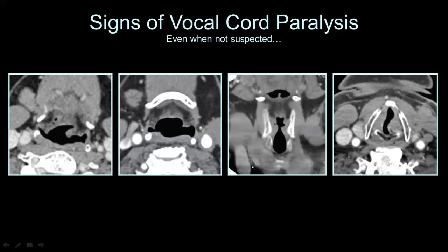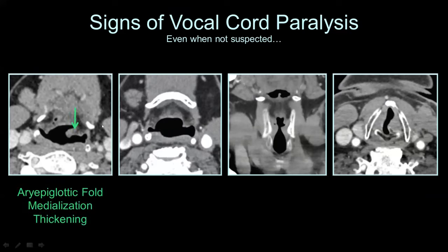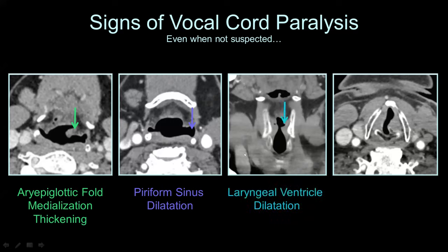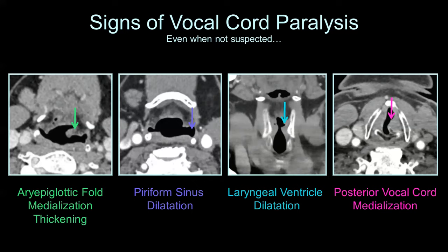Signs of vocal cord paralysis are always important to look for — you can pick it up even when not suspected. Here's a patient with several axial CT images and a coronal image. First sign: medialization and thickening of the left aryepiglottic fold. Second: the left piriform sinus is dilated compared to the right. On the coronal image, the ipsilateral laryngeal ventricle is also dilated. And on another axial image, there's posterior medial rotation of that left vocal fold — the so-called sail sign. These are the four signs of vocal cord paralysis to look for.